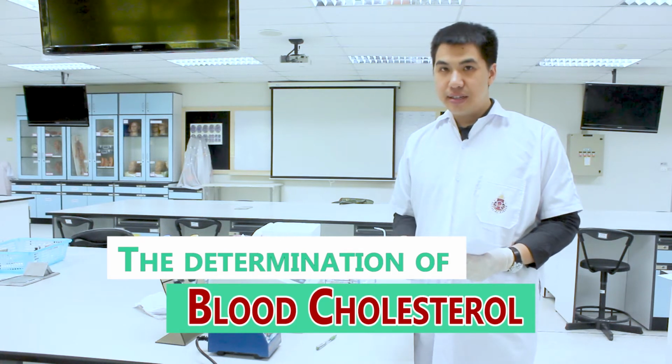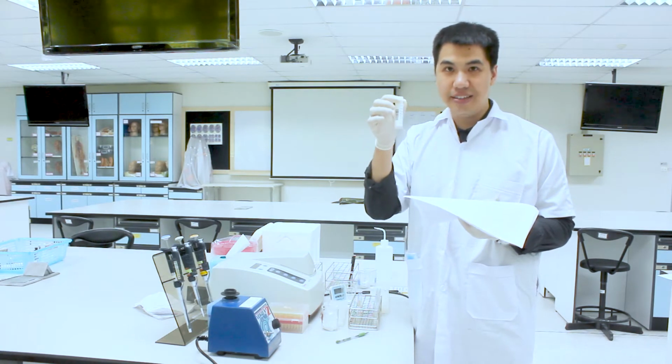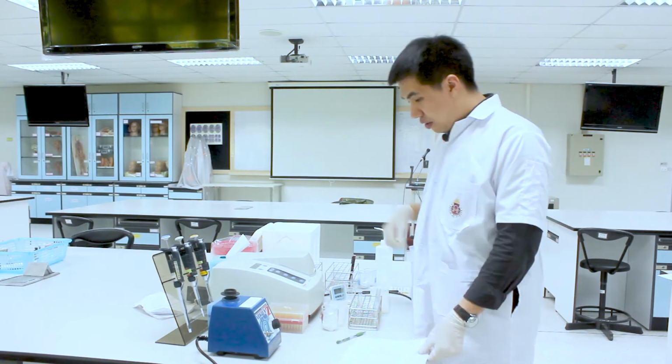In this laboratory, we're going to use a reagent that contains two enzymes. The first enzyme is cholesterol oxidase and the second one is cholesterol esterase. I hope you can differentiate between the roles of these two enzymes in the reagent. What is the role of an enzyme, basically?